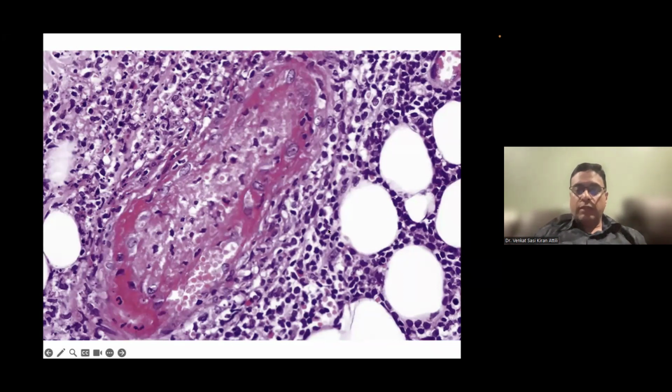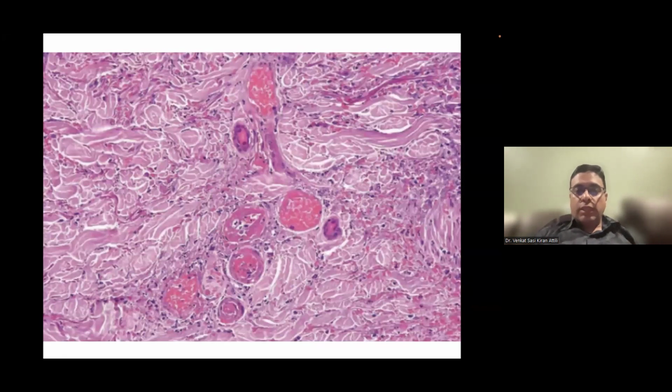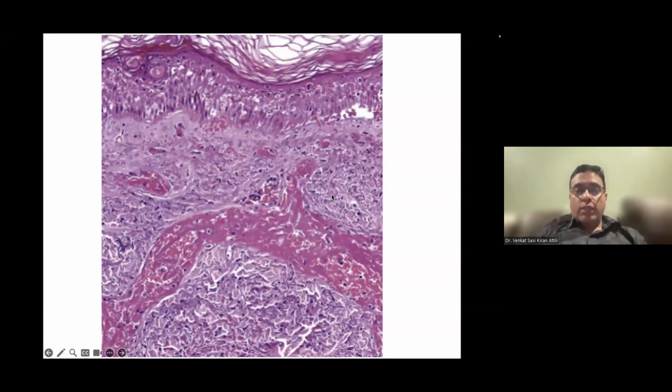Lots of lymphocytes as well here. So it's a later phase of the disease where neutrophils gradually get replaced by lymphocytes. Here you're seeing a lot of thrombus, extravasated RBCs. Here it's probably a later phase because the inflammation is particularly mild. It's not a typical example, but yes, in later phases of the disease, you don't see so much inflammation, but fibrinoid vessel wall necrosis and thrombus is present here, and also lots of extravasated RBCs. Now, when the necrosis of the vessel and thrombus becomes extensive, you see dermal necrosis and epidermal necrosis as well.